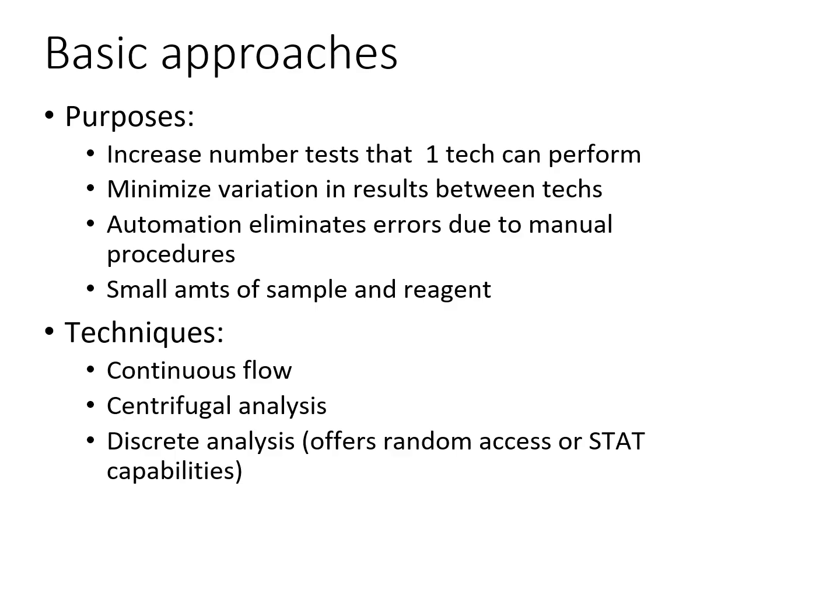So from benefits of the automation in lab, as you guys can probably guess, is higher throughput. So we have the ability to process more tests faster. We have the improved accuracy and precision, which helps reduce variability and errors. Flexibility, which is the ability to run multiple test types on demand. Cost savings, which has efficient use of reagents and staffing. And then enhanced patient care, we get faster results, which will lead to quicker diagnosis and treatment for our patients.